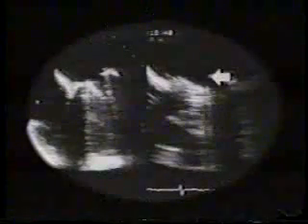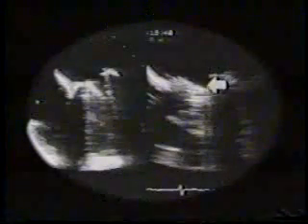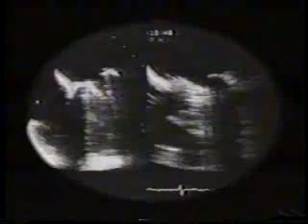The reduced opening angle of the Omniscience prosthesis is even more evident when it is compared to the normal opening angle of this Bjork-Schiley mitral prosthesis. At surgery, the Omniscience valve was found to have a large thrombus, which was inhibiting disc opening.